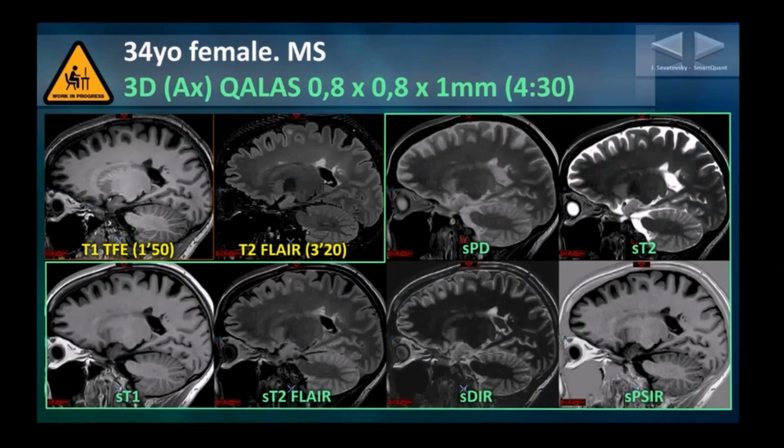So the first thing which I find very important is that now we have the ability for research of doing 3D sequences that are usable with SyntheticMR. So we can have in research for now, but it will soon be on the clinical practice side, a 3D sequence on which we can do isotropic voxels and reformat in every plane. And those sequences will, as the 2D examples that I have showed you, be able to generate several synthetic weightings.